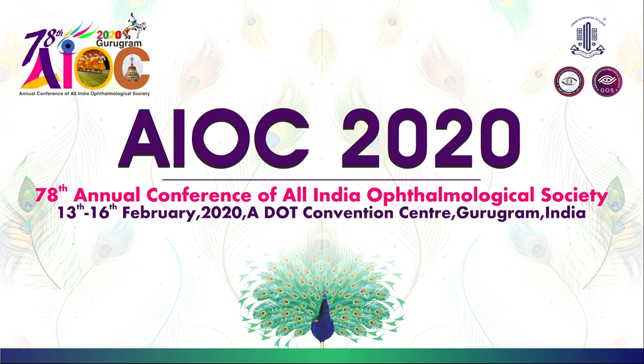Namrata, for DMEK surgery, do you put an S stamp on at all, or you just rely on the OCT? See, the first case that I did for DMEK, we had an intraop OCT microscope, and I did it without putting an S tag. In fact, the case that I showed you was the first DMEK that I was doing. But having said that, in hazy corneas, I think intraop OCT is a great tool. Because sometimes in hazy corneas, you can't even see the S tag.